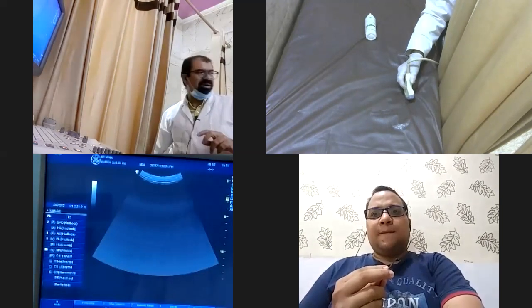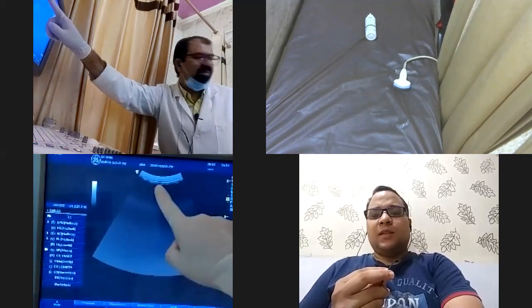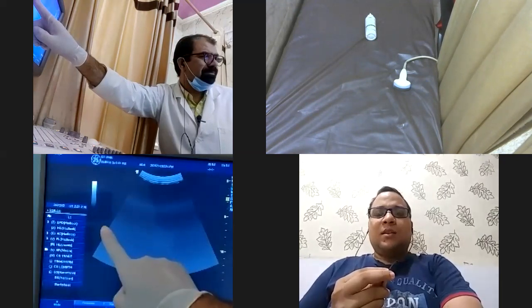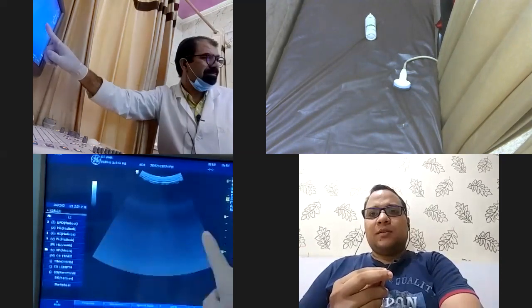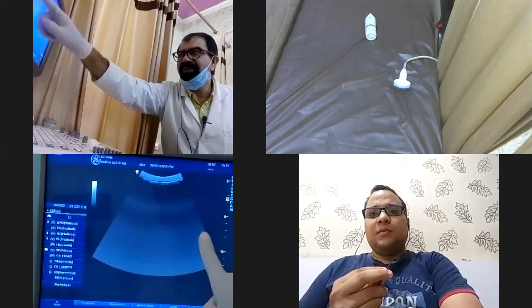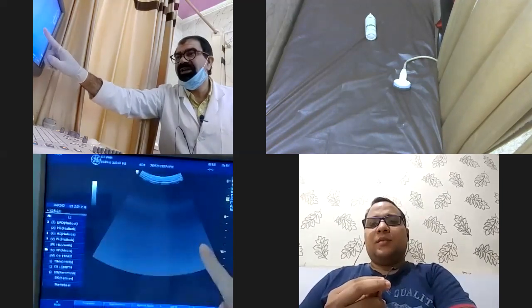Now see on the screen. Now I am in longitudinal section. Is this anterior? Yes, sir. Is this posterior? Now what is this over here? Is this right? This is superior, sir. Very good. So this is superior and this is inferior. So this side is superior. It means that right is now replaced by superior and left is replaced by inferior.